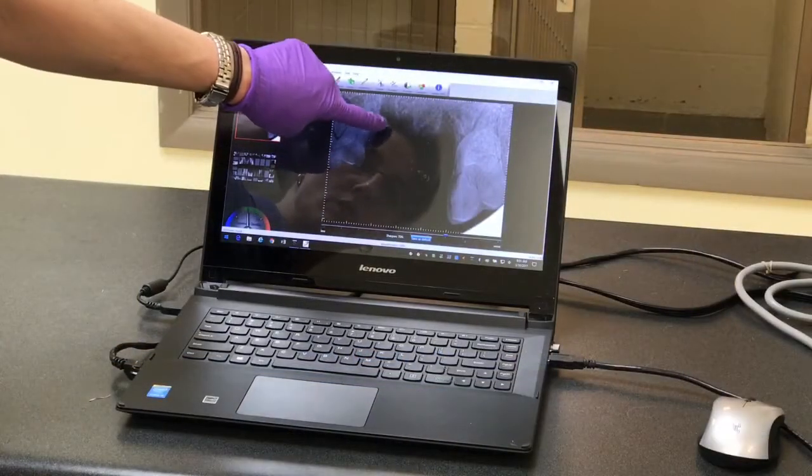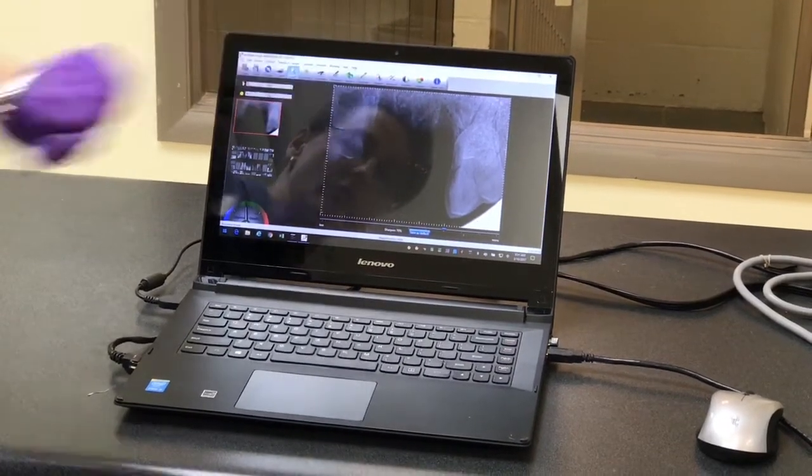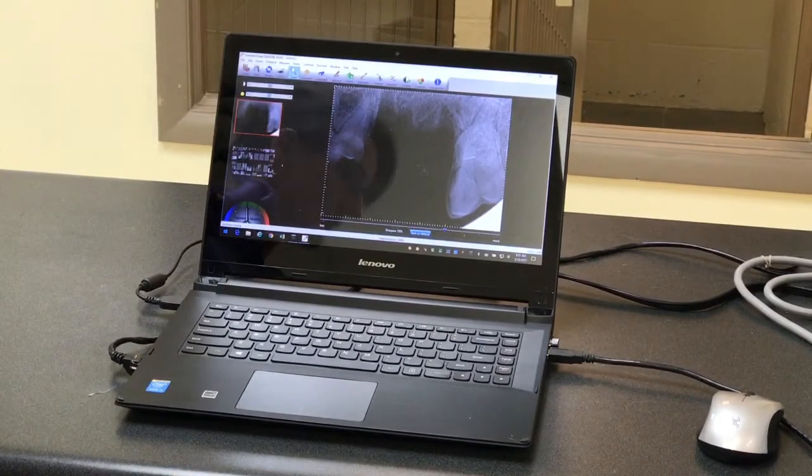Okay, so here's where our tooth previously was located, and we have confirmation that there are no root tips, which will cause problems in the future. So this is again post-extraction.